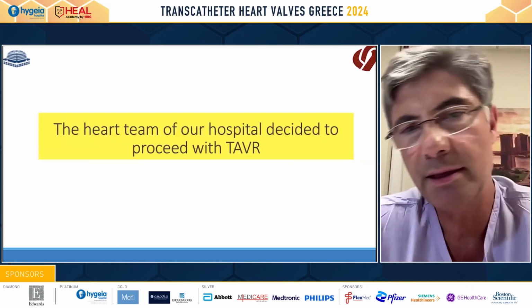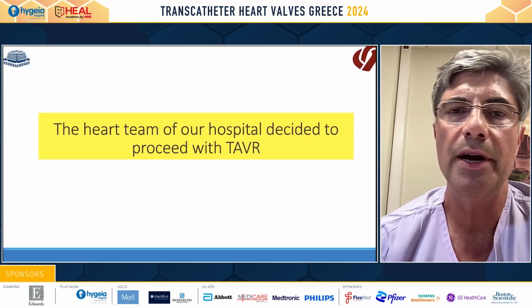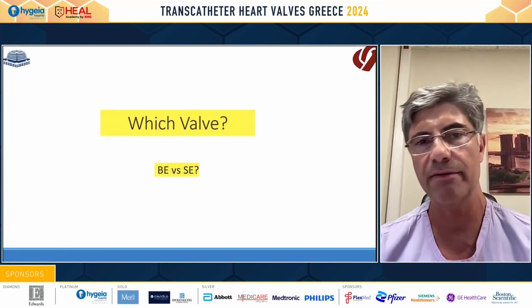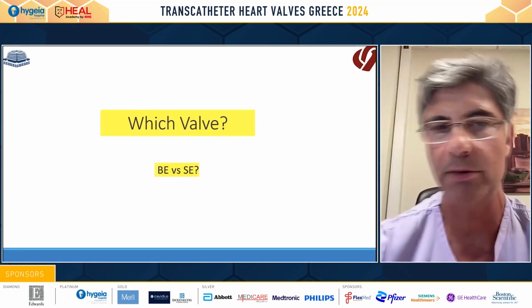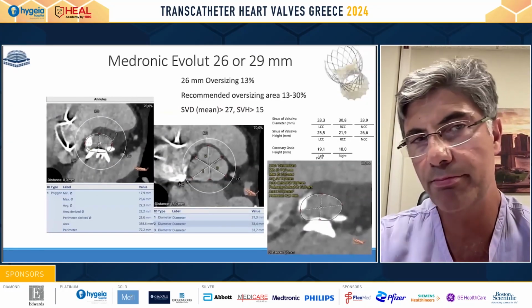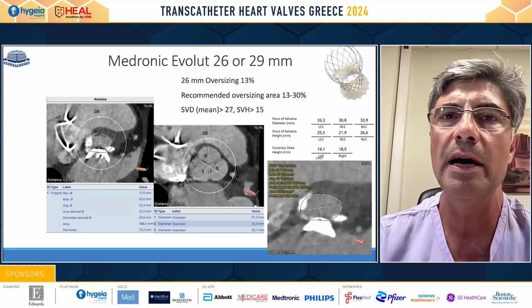So we discussed in the heart team of our hospital and decided to proceed, of course, with TAVI. So now we have to decide which valve to use, balloon expandable or self-expandable. So maybe we're on the borderline between a 26 or 29 Medtronic.